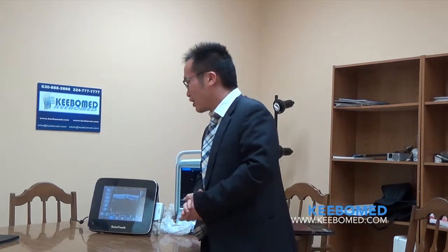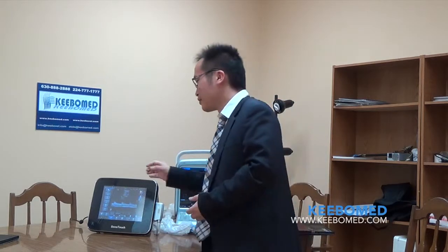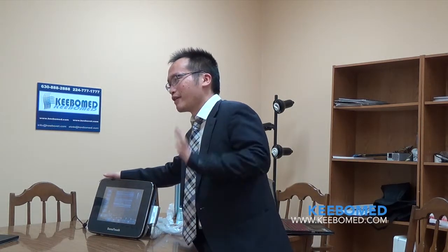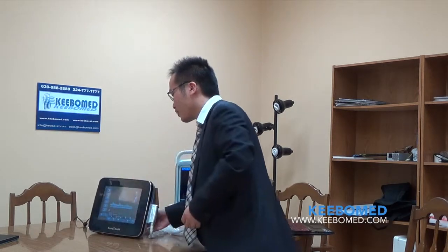Please allow me to introduce this model. This is a very interesting model compared with traditional ultrasound. Especially doctors who don't have strong ultrasound knowledge will appreciate this model. Firstly, this one is very easy to carry — very portable. It's very light compared with other models. This one is just less than 5kg, around 7 or 8 pounds, with battery included. With battery, it can work 2.5 hours, which is a very long time.